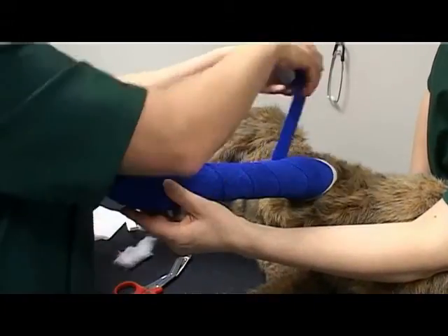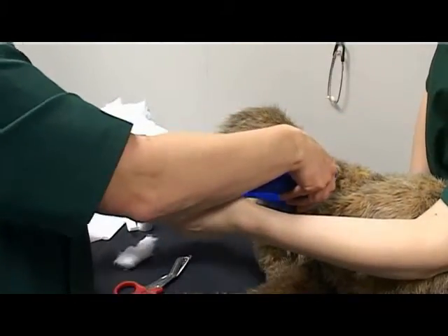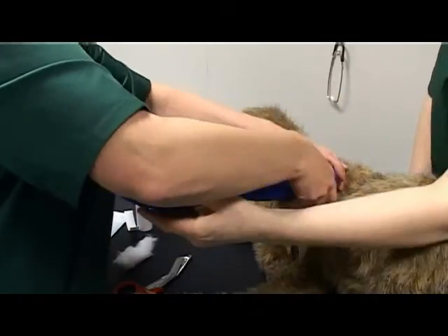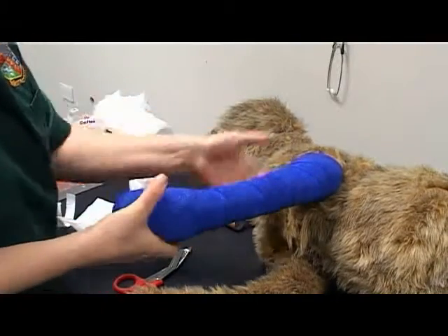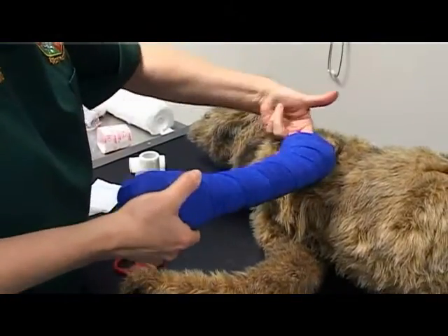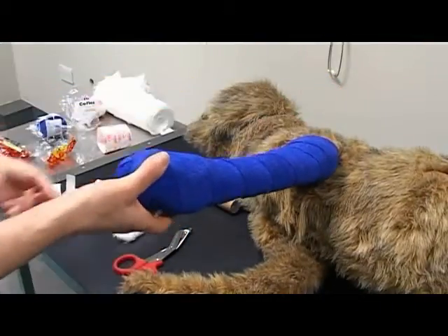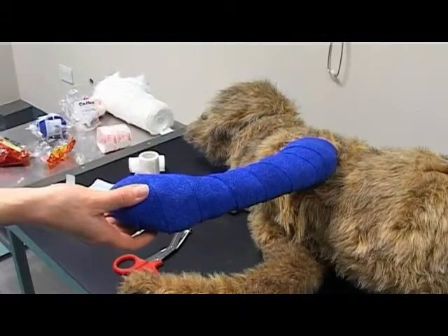Ensure there is no tension or tightness in this layer. Check suitable tension of the bandage, checking it is not too loose or too tight all of the way up. Use two fingers at the top of the bandage to check that the top is not too tight or too loose. Finally, check the bandage is neat and that there are no pieces of padding or bandage showing.